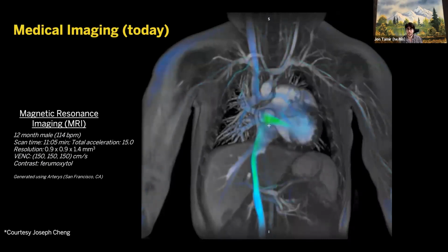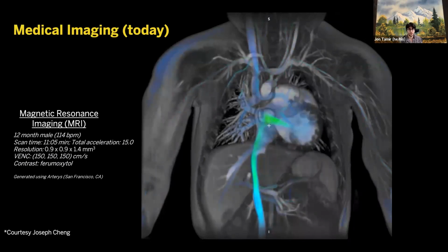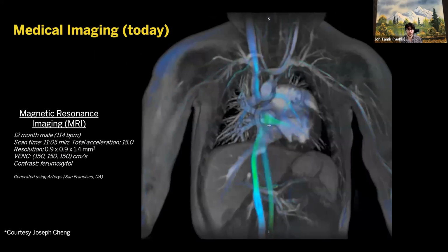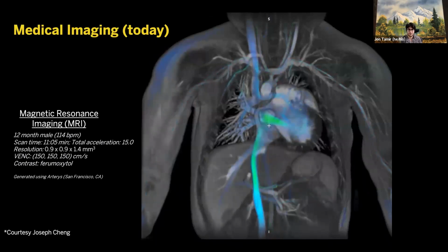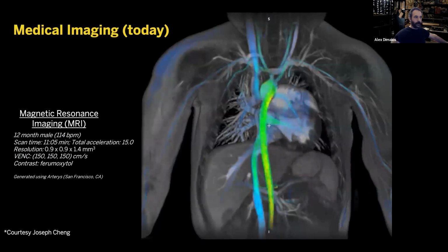And so if we can boost the SNR, we could potentially have a higher resolution. And so moving to higher field, that's one way to get higher resolution. If we use these models that let us reduce scan time and trade it off for resolution, we can do that. But resolution is really expensive. The SNR and resolution are inversely proportional. So that's really the bottleneck. If we want to move to 0.25 millimeter resolution isotropic, then we're essentially going to have a 60 times longer scan. I see. And nobody has ever done those scans to produce very high resolution images?